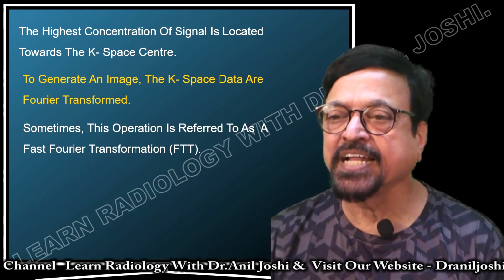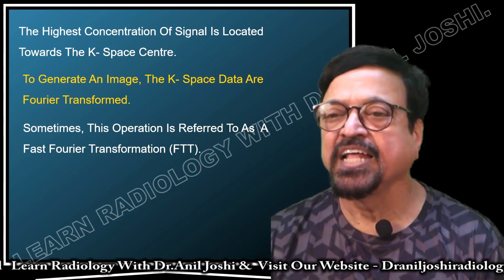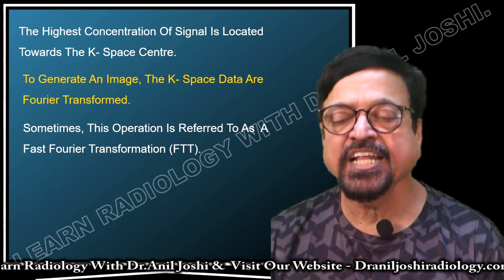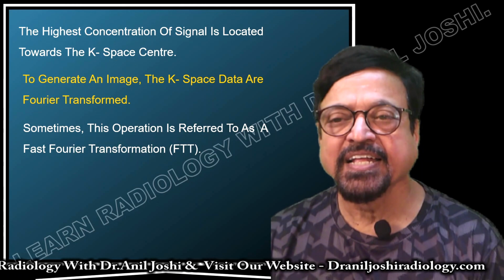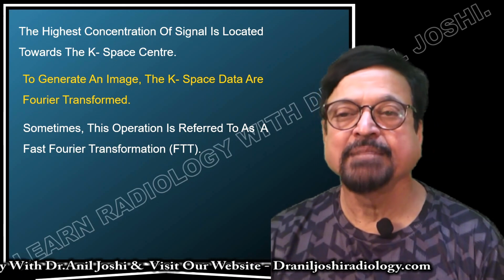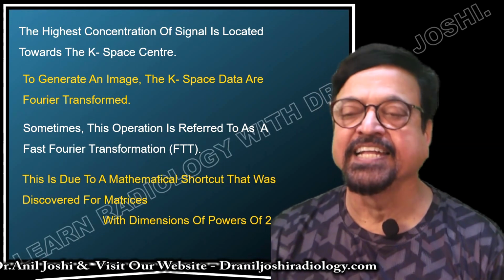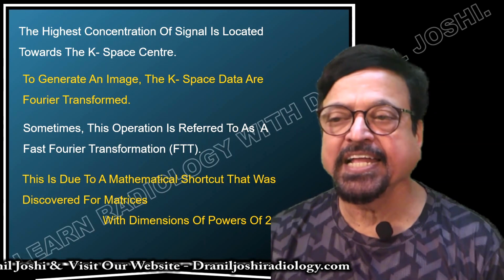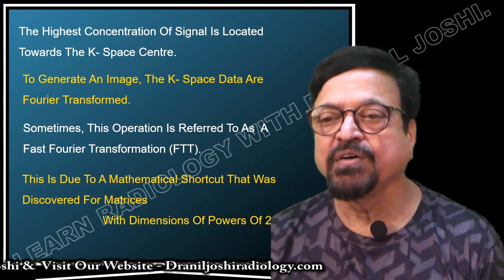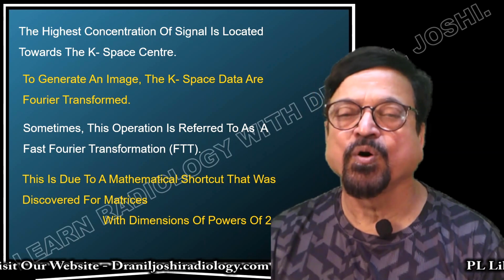Sometimes this operation is referred to as a fast Fourier transformation. Now, what is a Fourier transformation? There is a separate lecture covering this topic. Do visit it so that you can understand this concept better, or if you already know it, fine, there is no difficulty in understanding it. This is due to a mathematical shortcut that was discovered for matrices with dimensions of power of 2.